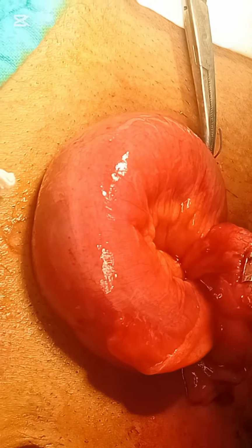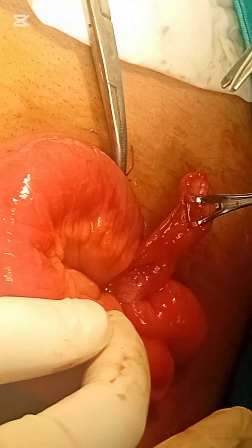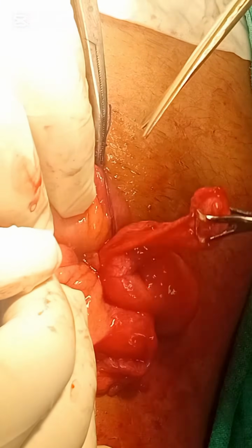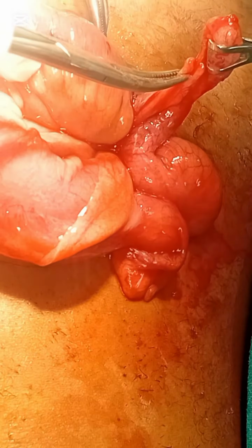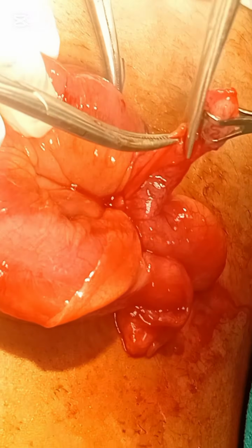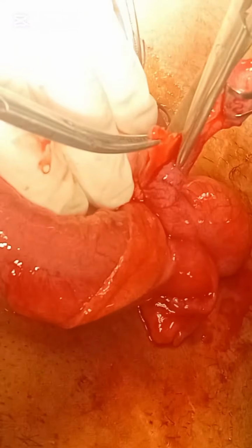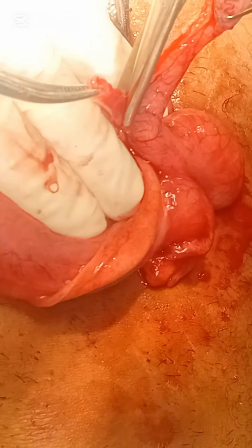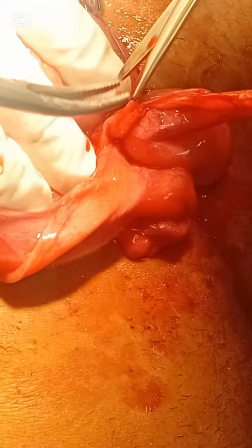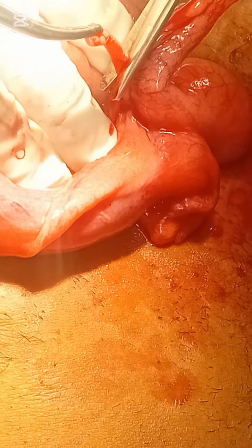Now hold the appendix with Babcock and incise the mesoappendix just medial to the appendix. Hold the mesoappendix with artery forceps and cut it with scissors. It will free the appendix from the mesoappendix. We have brought the gut outside just to make the view of the video clear. It is just for video purposes, because if the appendix is ligated intra-abdominally, we are unable to get a clear view of the appendectomy.